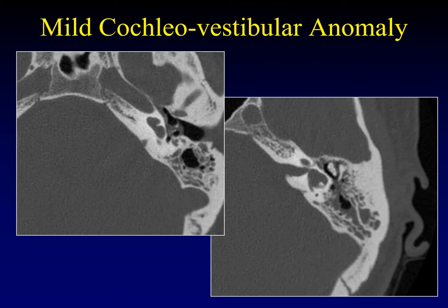Here is a mild cochlear vestibular anomaly, moving further along the spectrum to a more differentiated ear. You can see that the cochlea is actually separated from the vestibule — you can almost get a sense that it was going to start to spiral up at some point. The lateral semicircular canal is severely dysplastic but has its central bony island, and you can see the posterior semicircular canal coming off. All the elements are present, though clearly severely dysplastic.